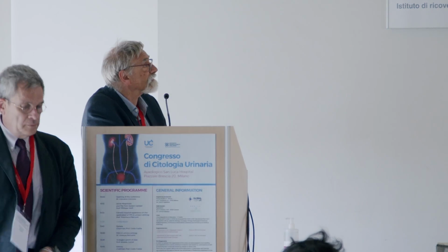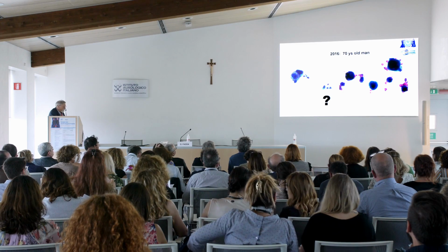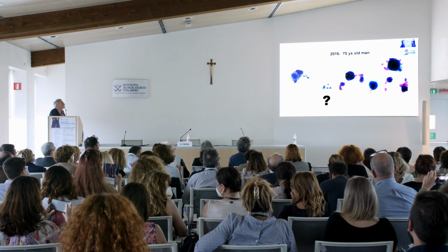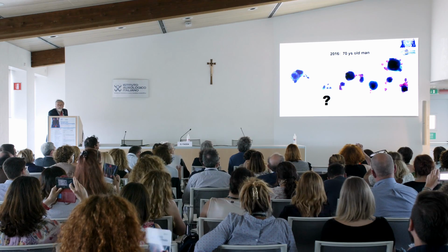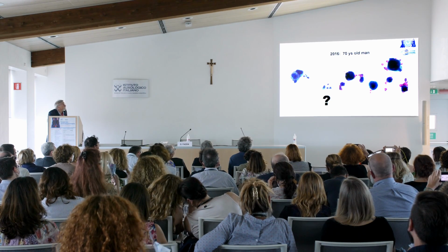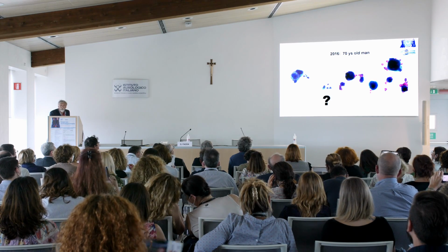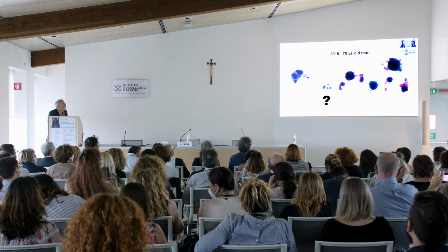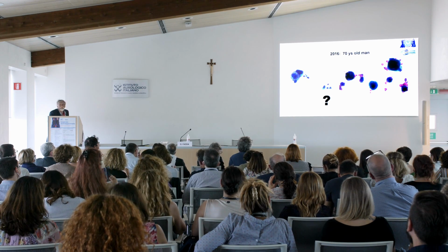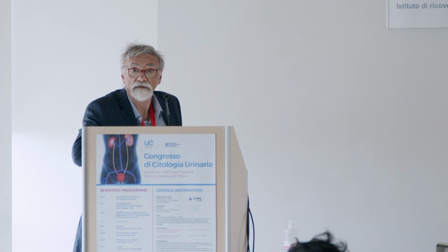The first thing to be noted is that there is no clinical information, but the average information we have when examining urinary cytology is the age of the patient.